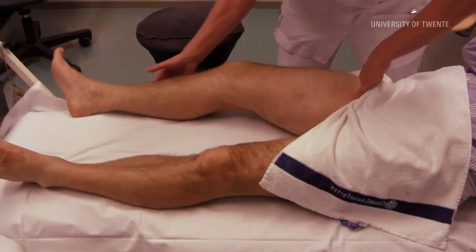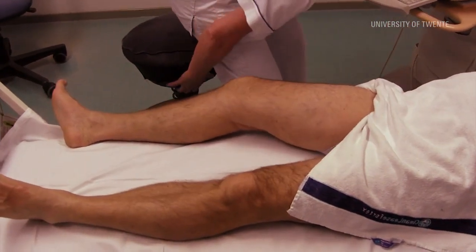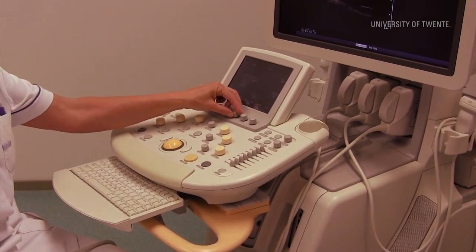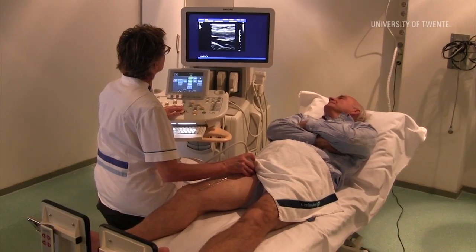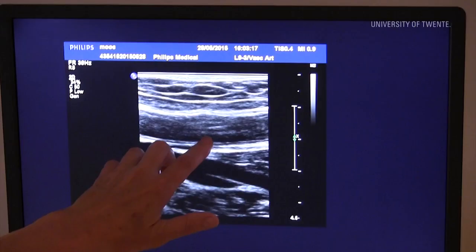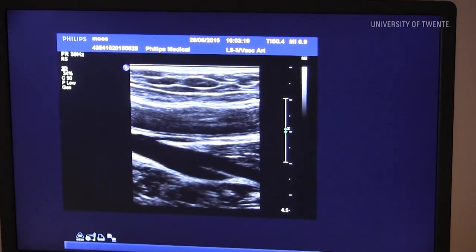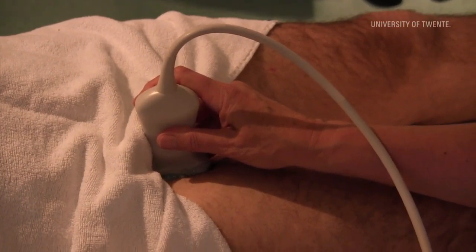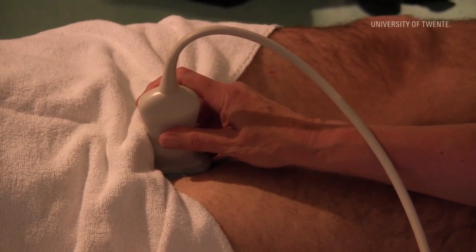The sonographer Hanneke Hemink is assessing the arteries in the leg, starting from the iliac arteries. Ultrasound with the characteristic 2D images provides us information on where the arteries and veins are located, by knowing the anatomy. By looking at the structure of the vessel wall and applying compression with a transducer, we can identify the artery.